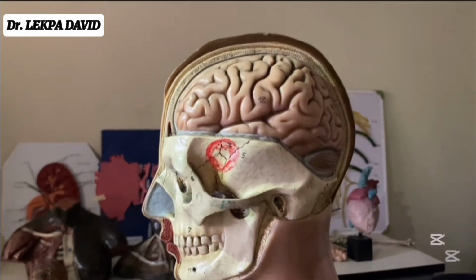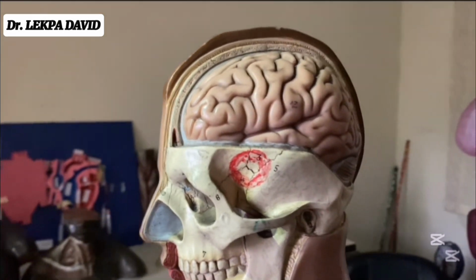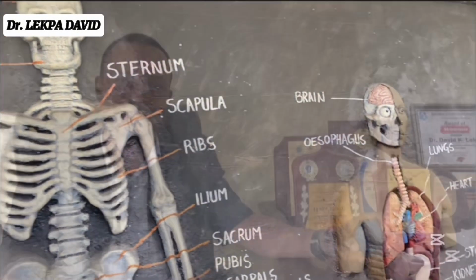For some time now, we've been trying to perform craniotomy in my lab. That is using a stereotactic machine to open the skull to the brain and expose the brain for micro injection or to cause injury to any of the cerebral cortex. Guess what? We performed this experiment in the lab, and did the rat survive? Watch this video and see if the rat survived. We did this experiment here in the Department of Anatomy, University of Port Harcourt.